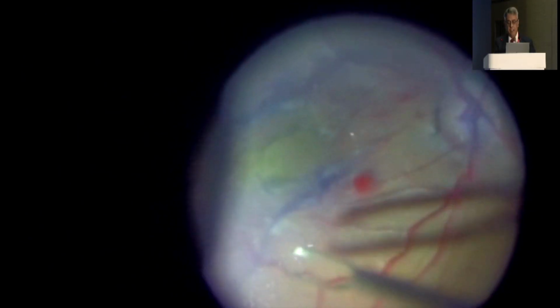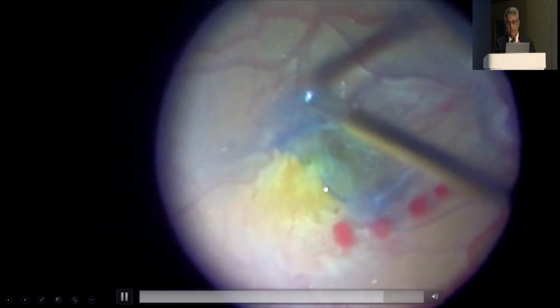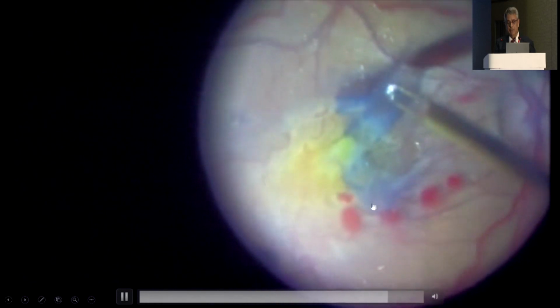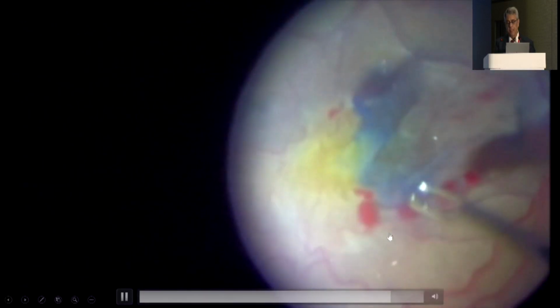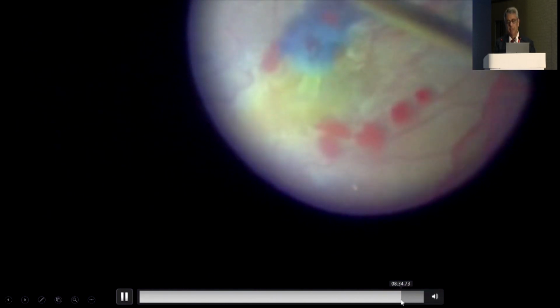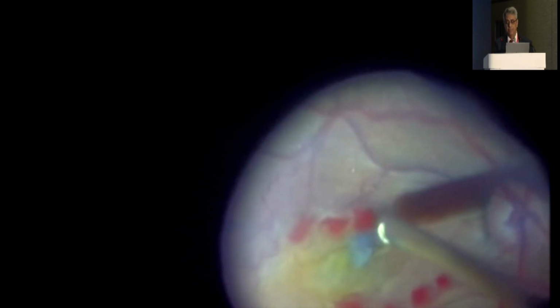So here, once we started taking it towards the fovea, I thought the underlying retina was very much adherent, and you notice this blanching of color here and reflex. So what I did was I made a cauliflower, like you see this whitish reflex. So don't be aggressive. Go towards some other side and try to make it a cauliflower. And after that, instead of pulling, I brought in a cutter inside and then took off this membrane. Here comes the cutter, and after you have made this, it comes relatively atraumatically rather than keep pulling and pulling and pulling.